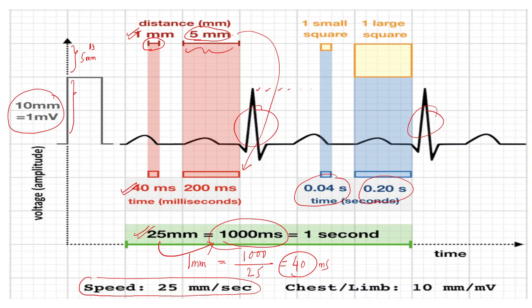Between the two R waves you can count 15 small boxes. So 1500 divided by 15 gives 100 beats per minute. Since 15 small boxes equal 3 large boxes, 300 divided by 3 large boxes also gives 100. So in either way you can calculate, and here the rate is 100 beats per minute.